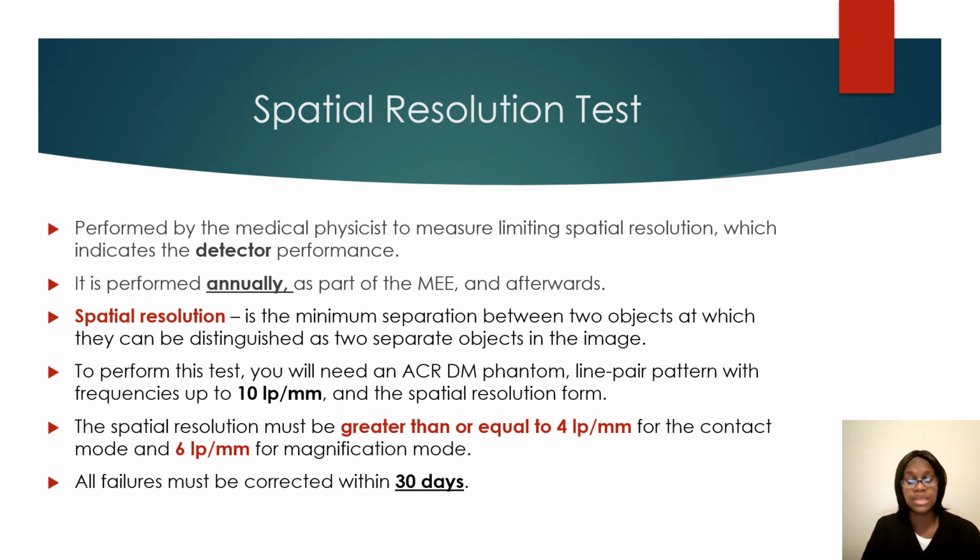Spatial resolution is an important term to remember because it is also commonly confused with contrast resolution. With spatial resolution, it is the minimum separation between two objects at which they can be distinguished as two separate objects in the image.